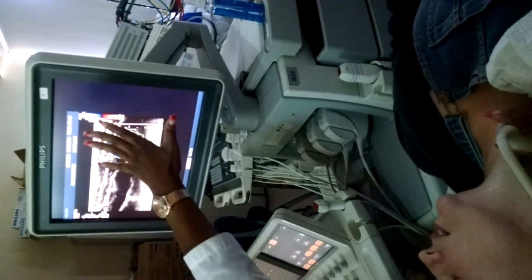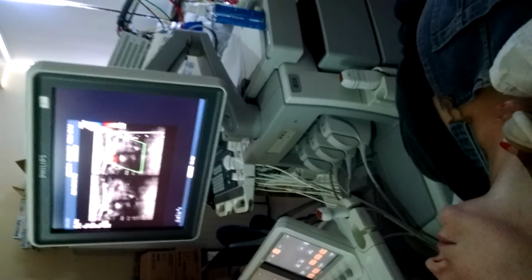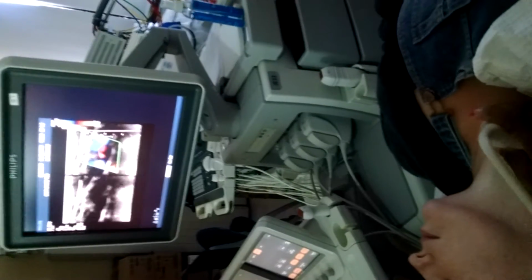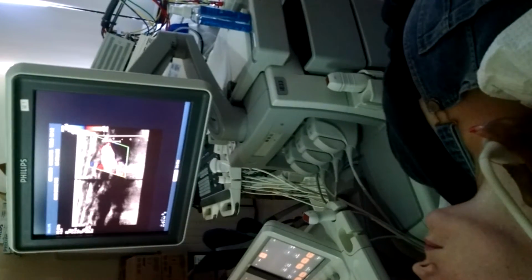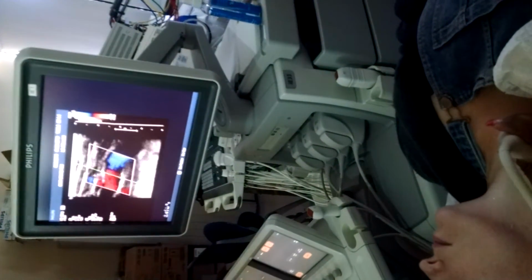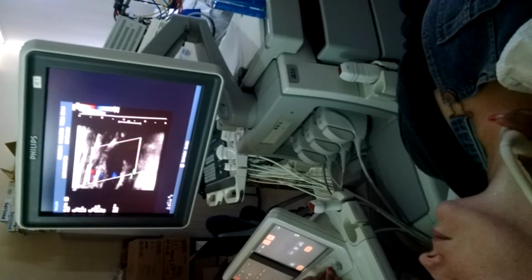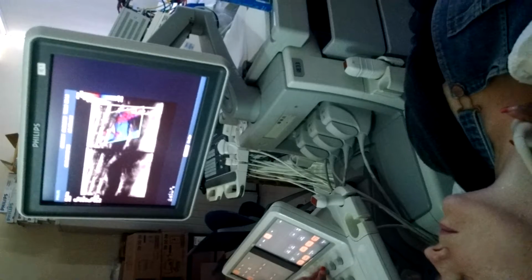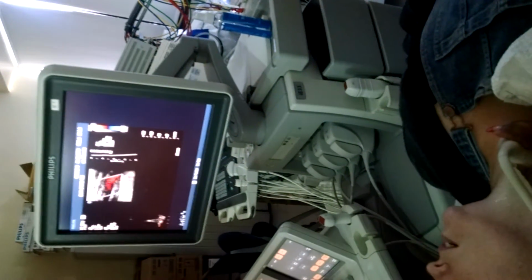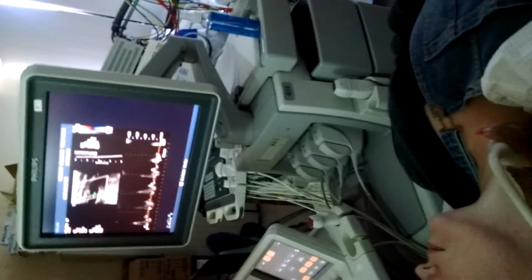It goes more superiorly that way. And the innominate is always going to be angled down. Let me show you. There's the common right there. There's the subclavian. Yeah, that's just a mirror image. I think we could use a higher frequency on her if we had it, but I don't think we have one. It says we're on gen, right? Yeah, that's a mirror image. You'll learn about that. But this is the true vessel.